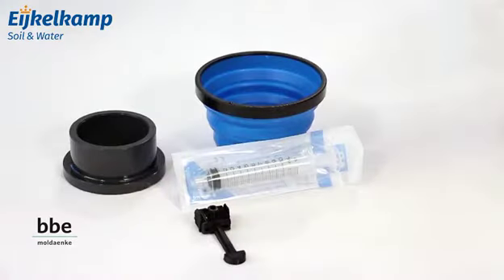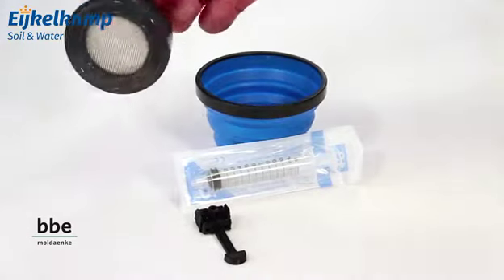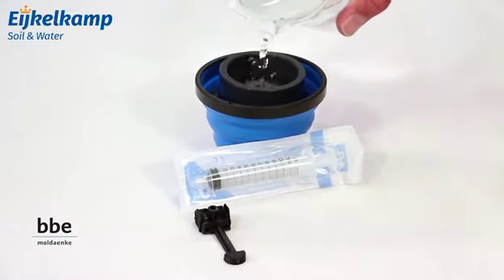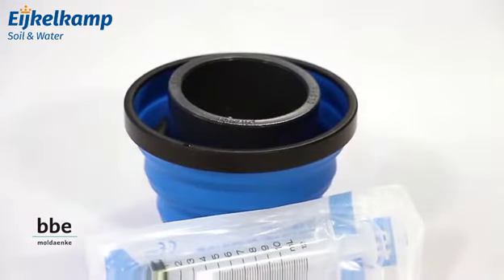This is all you need for a measurement. Of course you also need a ballast water sample and a TenCells device. To start with, take the ballast water sample and pre-filter the water sample into a cup. Use a 50 micron filter in accordance with the IMO D2 norm.